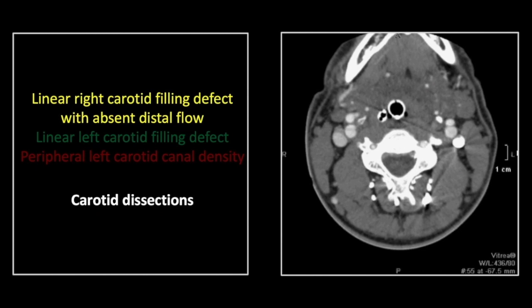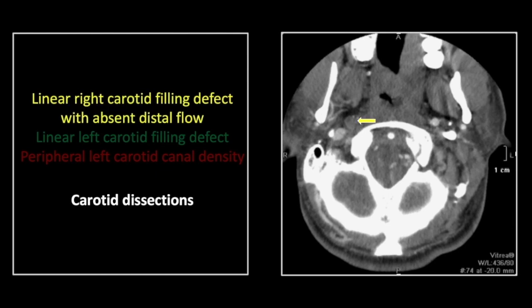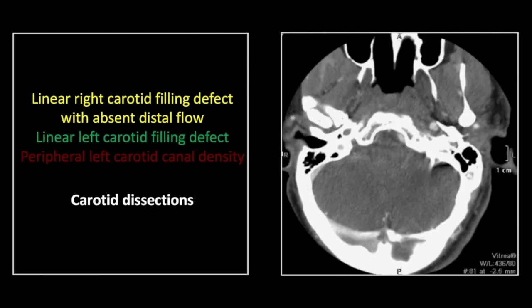Our next case is carotid dissections. On this lower cut, you can see a linear filling defect in the proximal right internal carotid artery. Higher up, near the skull base, there is no flow at all in that right internal carotid artery. At the level of the carotid canal, that vessel is empty of contrast, in marked contrast to the opposite side. Perusing the opposite side internal carotid artery, you can appreciate a slightly irregular contour and a linear filling defect. This is a common location for traumatic carotid dissections — at the base of the internal carotid, above the bifurcation, but also here at the skull base.